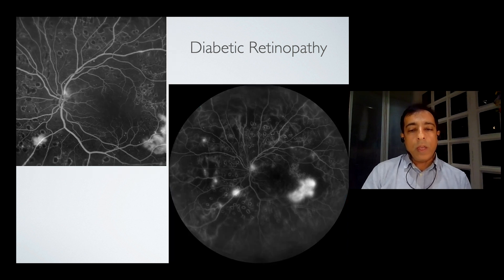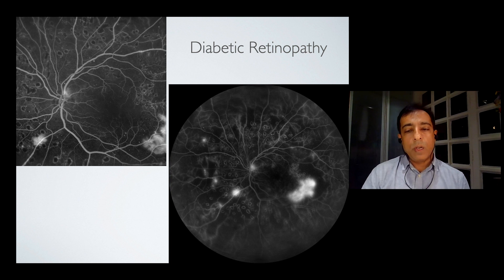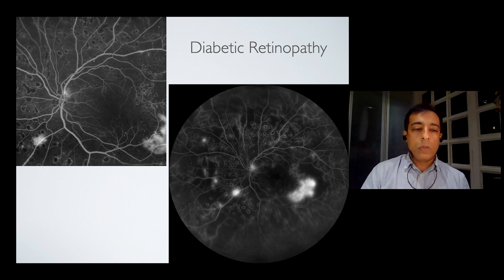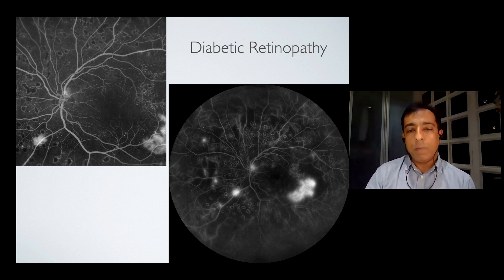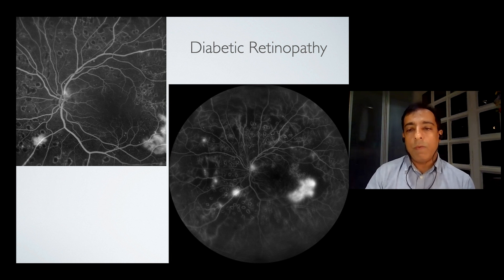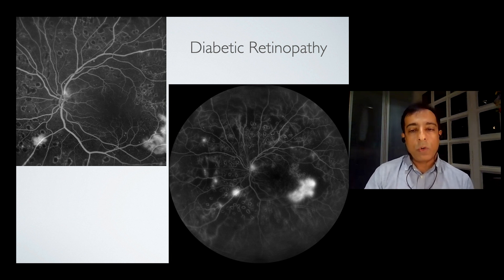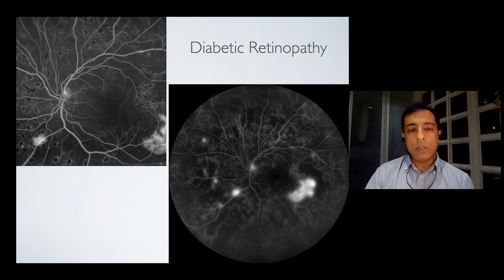As you do the angiography, you see the extent of CNP areas as well as the proliferations. Also on the nasal side, you see in the peripheral field a few areas of leak which would require a lot of top-up laser to regress these lesions.